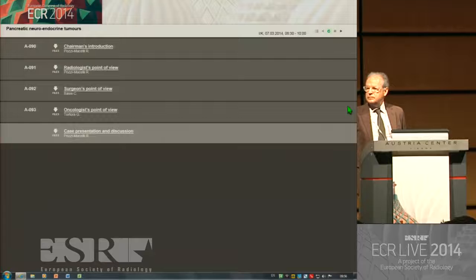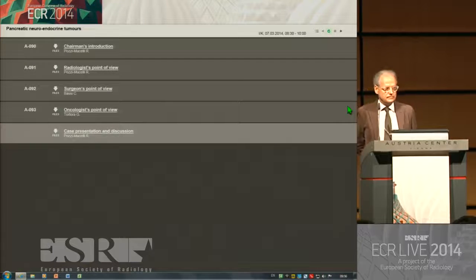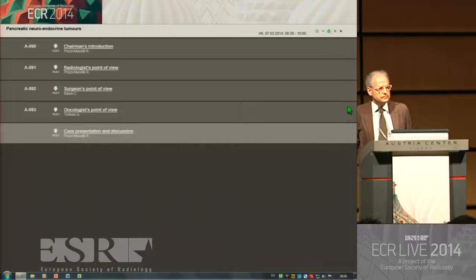And I think from a radiological point of view this is very important, because there are some imaging methods that focus only on one lesion, and we need a more panoramic view. So in this example, for me, CT perfusion is better than contrast ultrasound focused on only one lesion.